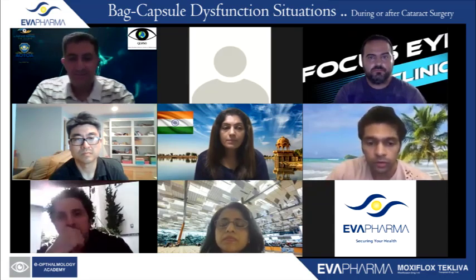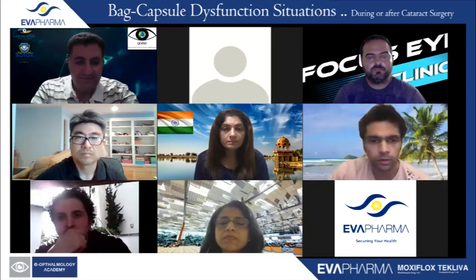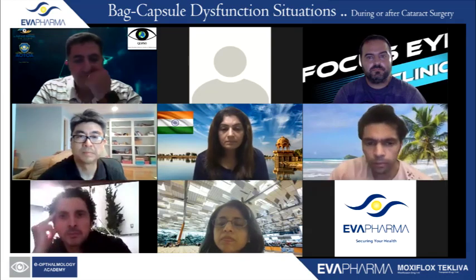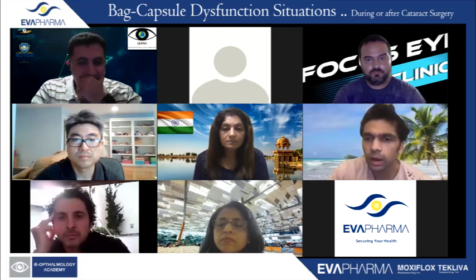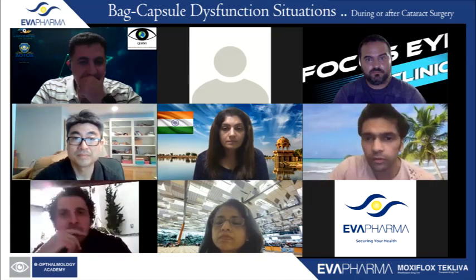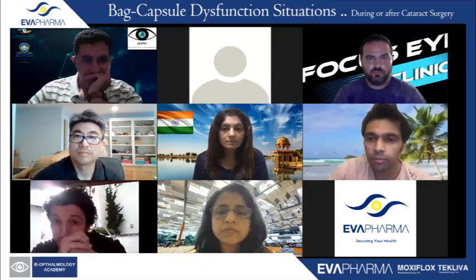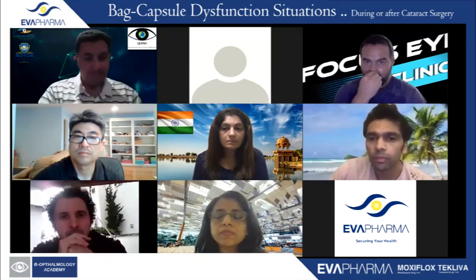Okay. Lukan, there's a question, and I wanted to ask the panel, does anybody else do iris suturing fixation techniques in their cases? Okay, so I'll just ask Lukan then. In case of pseudophacodonesis, is that a problem in iris fixating in a vitrectomized eye? This is a question that one of the audience asked. If the eye is vitrectomized, there can be a movement of the iris diaphragm with the lens. So probably there I will choose Carlevale lens.